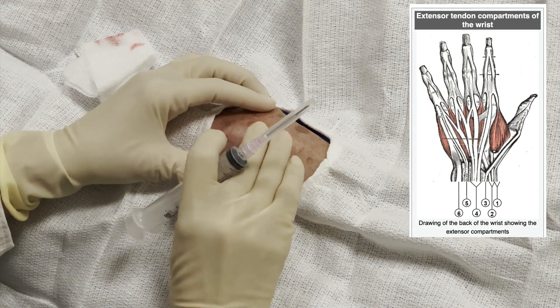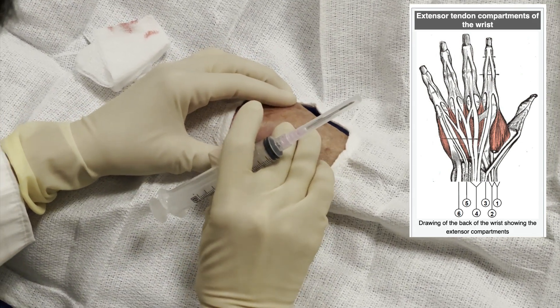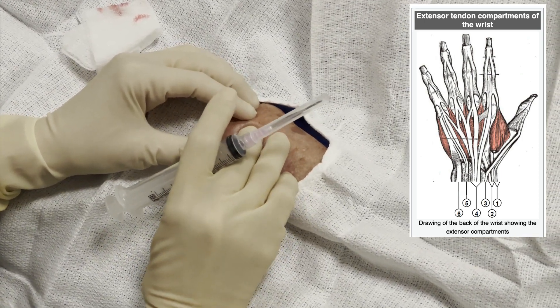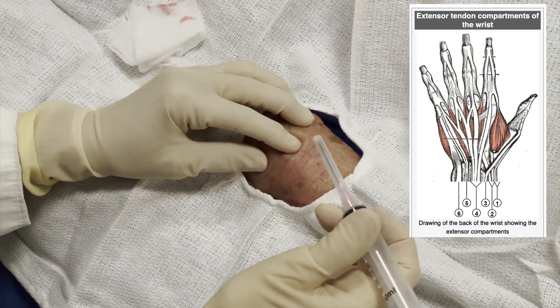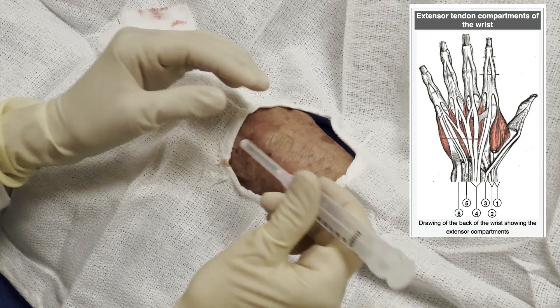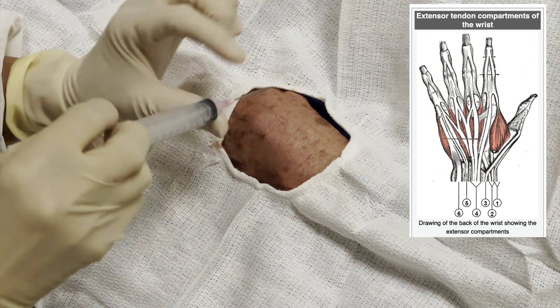I go back again to palpate carefully and once again just getting my bearings, because this compartment was so full I can feel the palpable joint capsule. Compartment four contains two tendons: the extensor digitorum communis tendon and the extensor indicis proprius tendon.